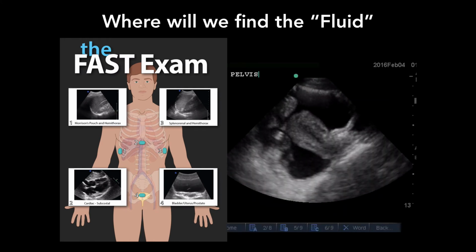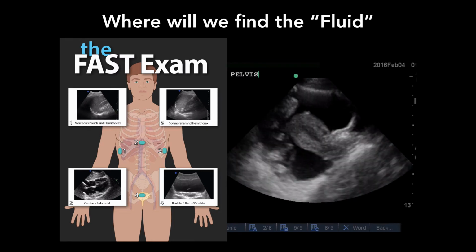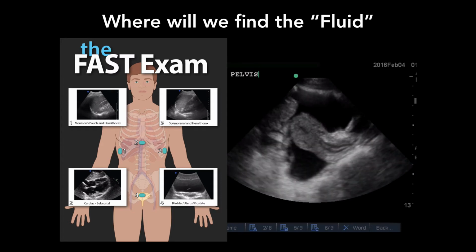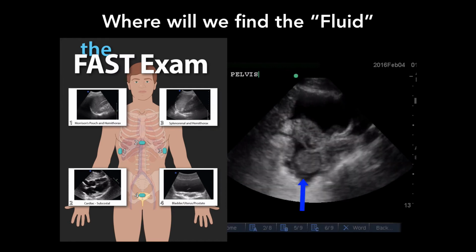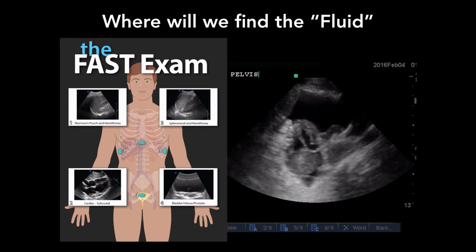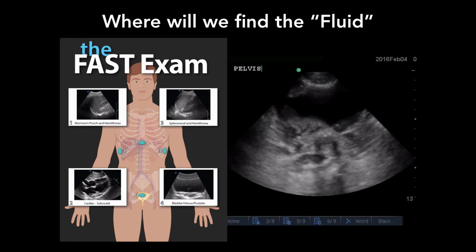Okay. Here is down in the pelvis, and we have the uterus. Notice that fluid's our friend, so it's so easy to see the uterus. See how well you can see the uterus because it's got fluid on both sides of it. It outlines it. What's this space called back here, back behind the uterus? Rectouterine pouch, or the pouch of Douglas. We'll talk more about that in a second. Here it is in cross-section. You can see the bowel is outlined too.